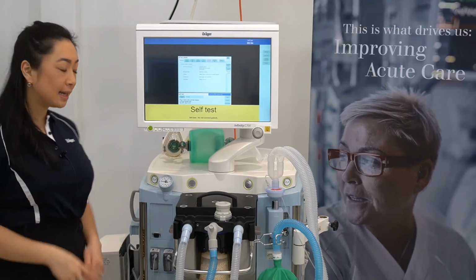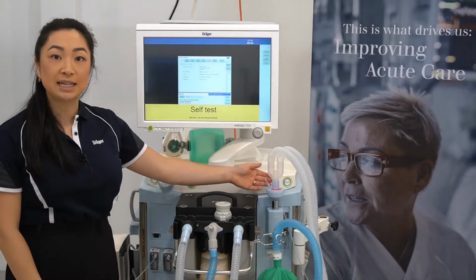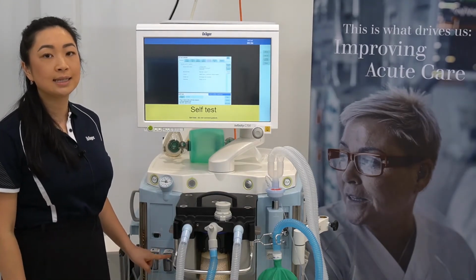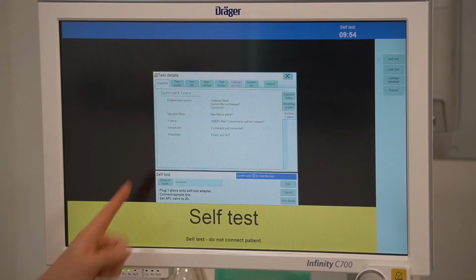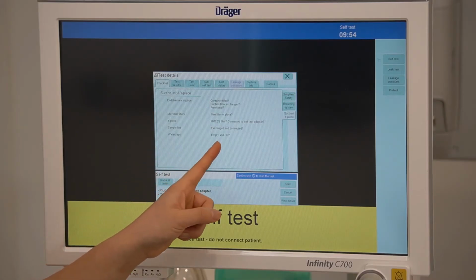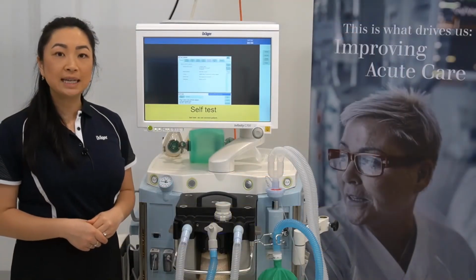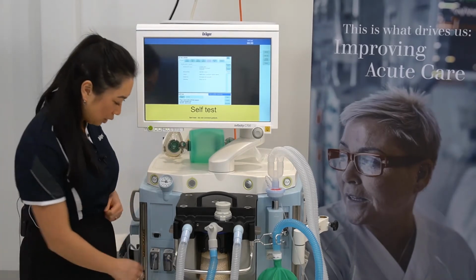Now that we've covered the supply safety checklist, we can move on to the breathing system checklist. To verify your anaesthetic gas scavenging system is connected and the flow adjusted, ensure that you turn your anaesthetic gas scavenging on at either the wall or the pendant.